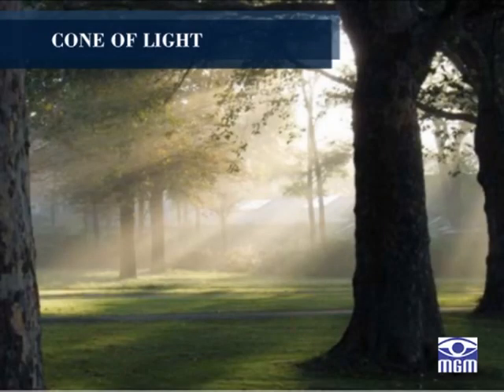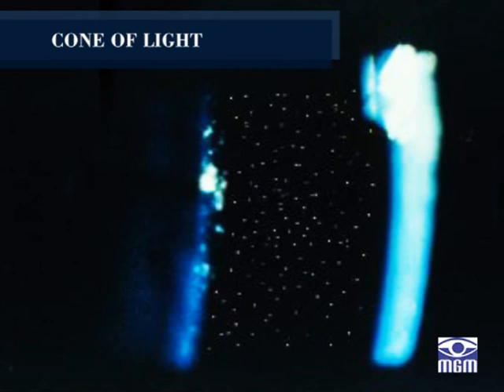The cone of light is based on Tyndall's phenomenon. Pinpoint illumination is maximally effective at isolating aqueous cells and flare.